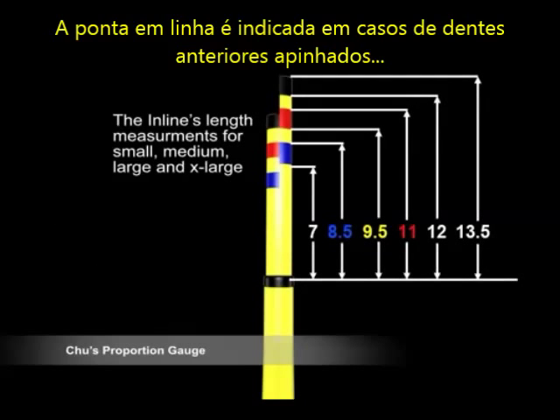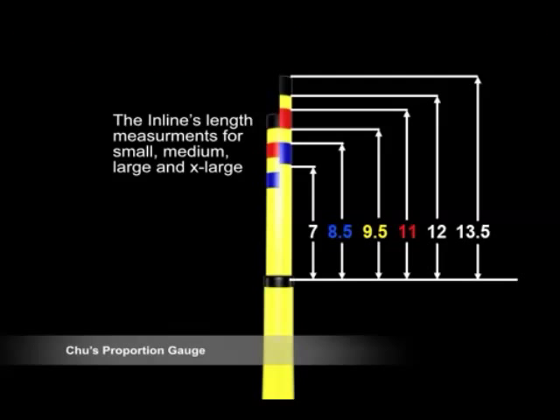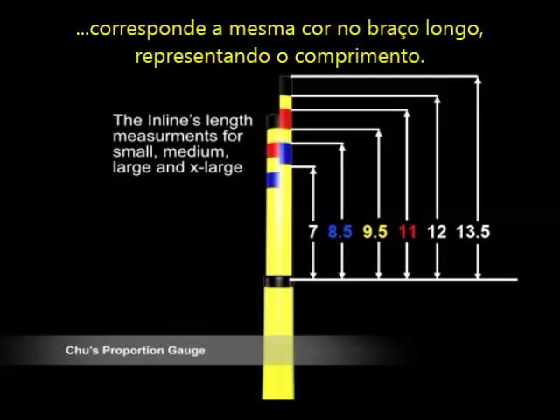The inline tip is indicated in cases of anterior dental crowding where the length and width cannot be measured simultaneously using the T-bar tip. A particular color band on the short arm representing the width corresponds to the same color band on the long arm representing the length.